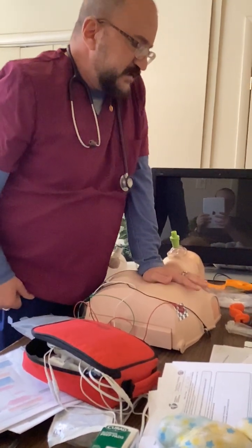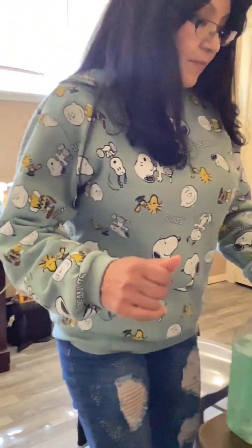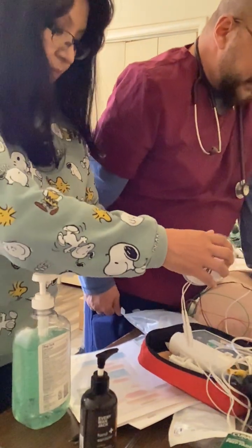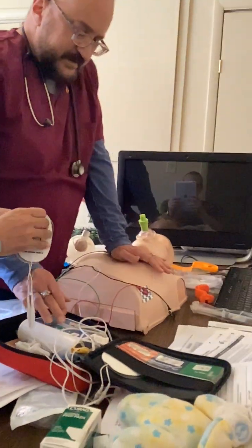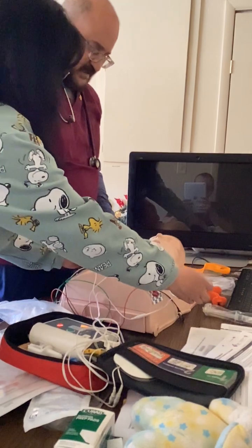Davina, get the AED. 6, 7, 8, 10, 11, 12, 13, 14, 15, 16, 17, 18, 19, 20, 21, 22, 23, 24, 26, 27, 28, 29, 30. So turn it on. But look at where the pads are.